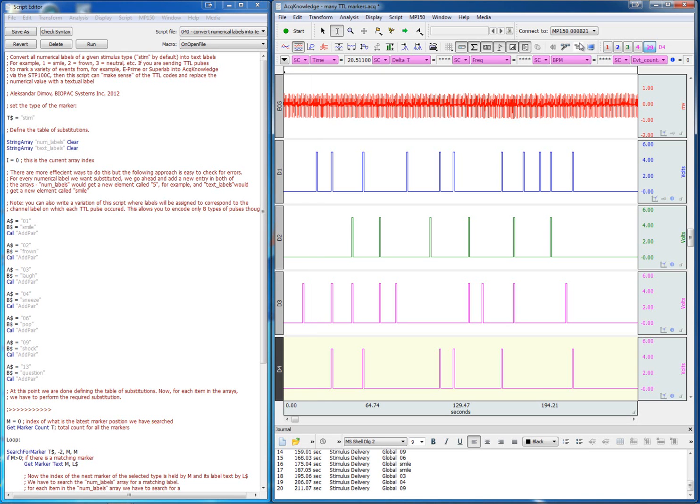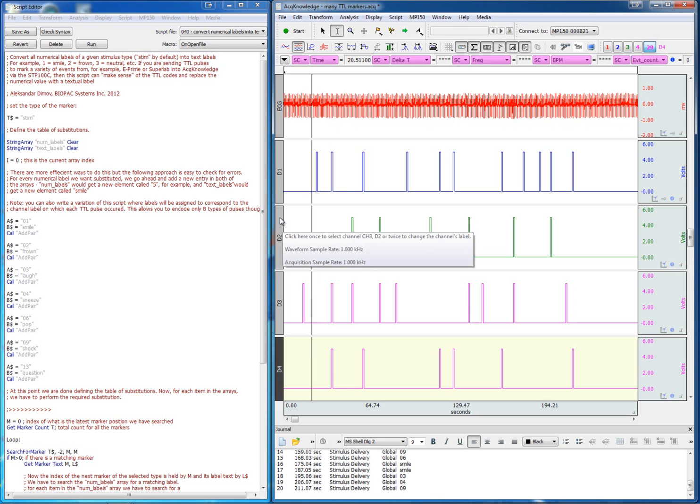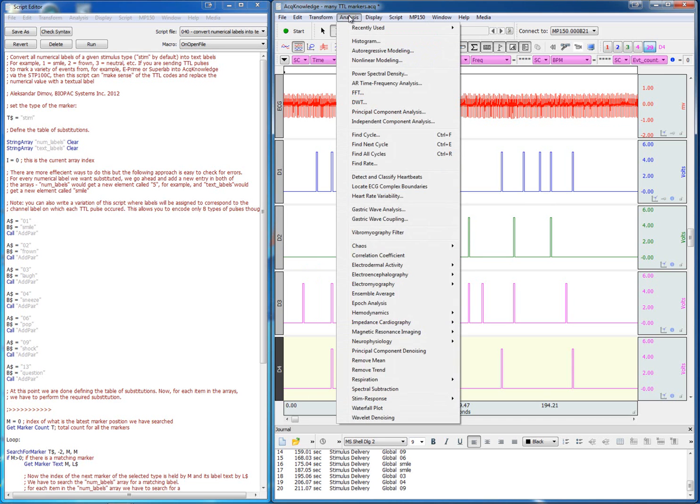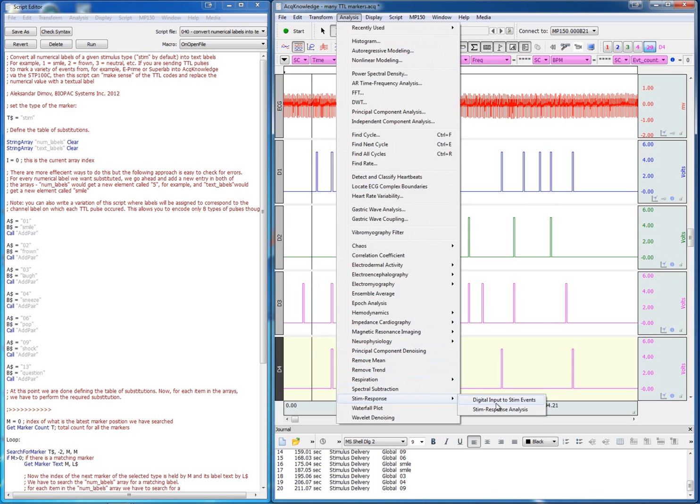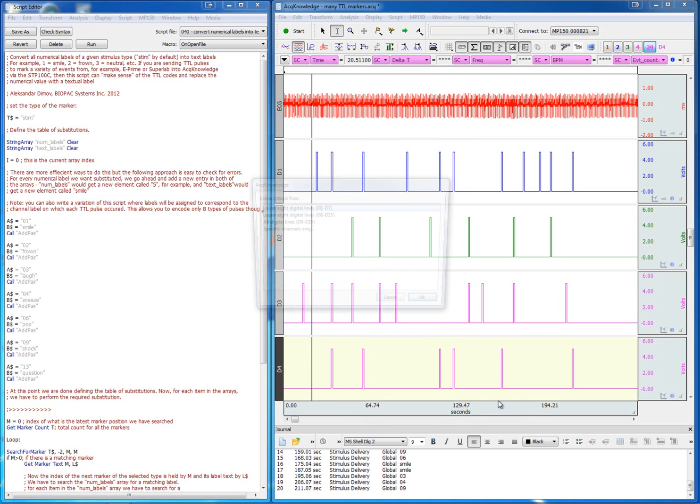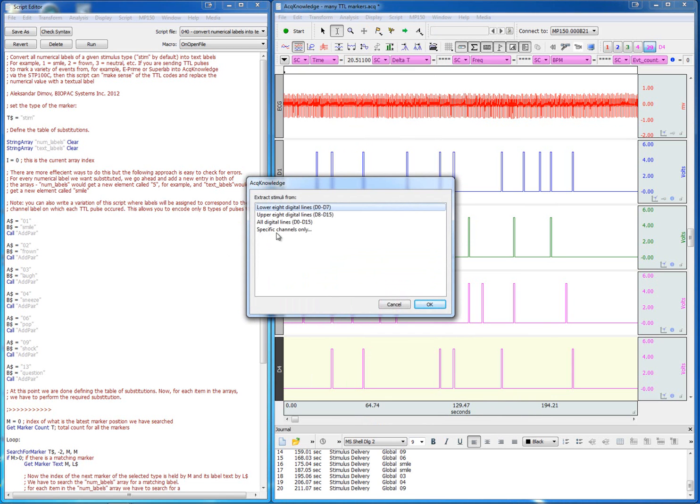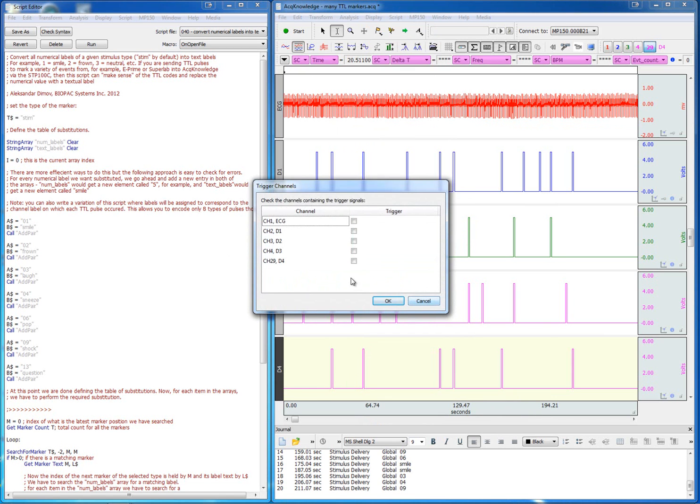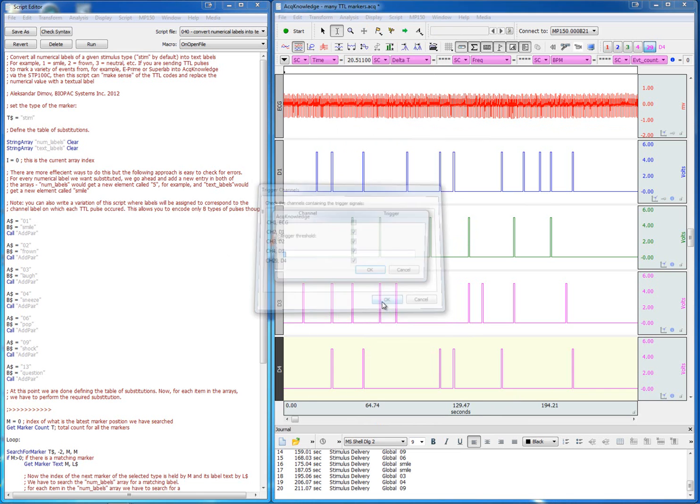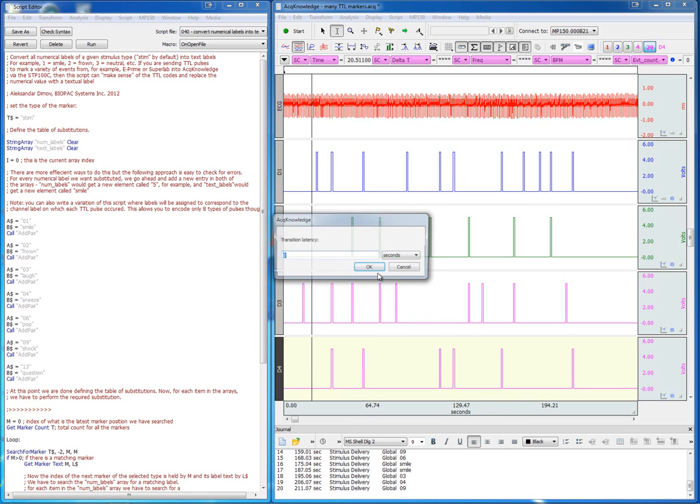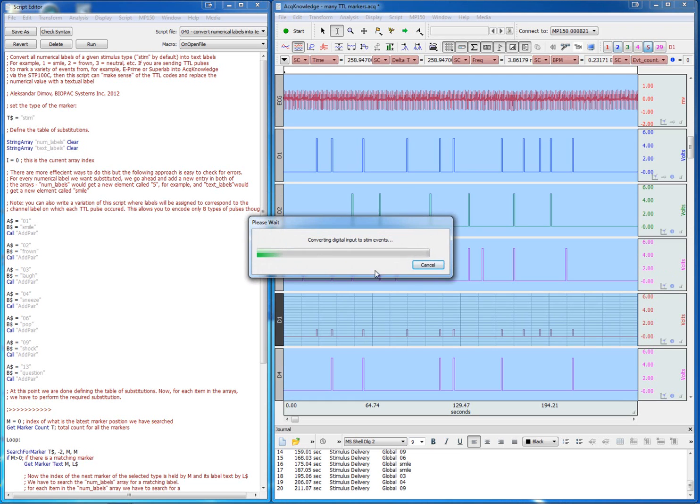Acknowledge software makes it quite easy to convert digital channels into markers that correspond to stimulation events. This can be done through the stim response menu where we define the digital channels that contain the marker information and simply have the software go through them.